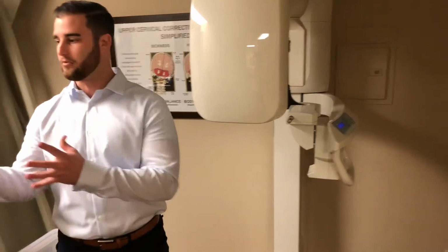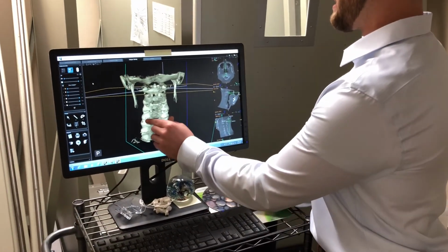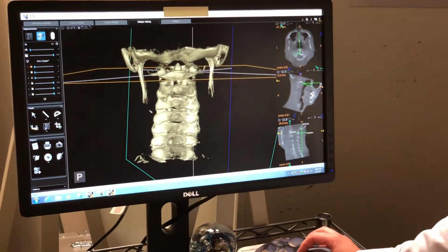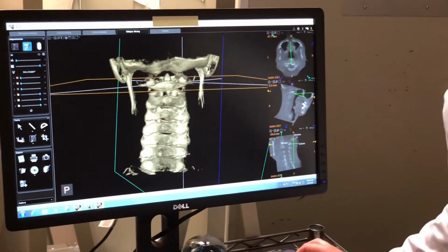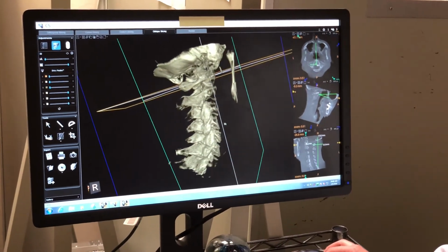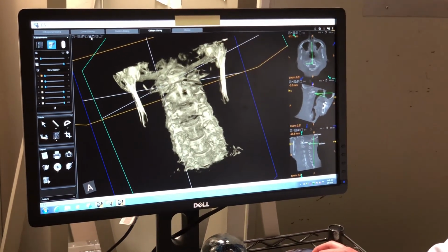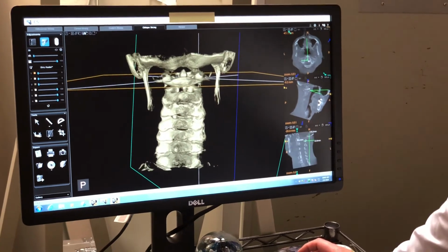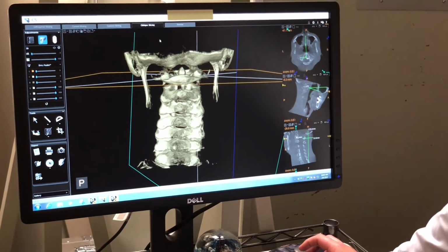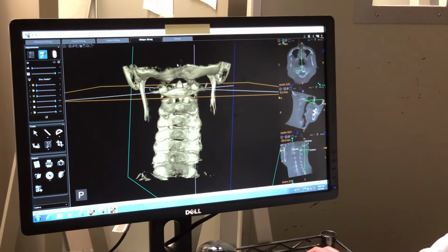So I'm going to show you what a real-life scan looks like of a patient that we began working with last week. This is the detail of the image that this scan produces. In terms of seeing what's going on in the neck, there's really no detail that can be left unfound. This image can be manipulated to show every single angle of what's going on in the neck. This patient in particular has been having a lot of neck pain, restricted range of motion, has been getting migraine headaches, and hasn't been able to sleep in the evenings because she can't find a comfortable position. I should add that this is about a 45-year-old female.